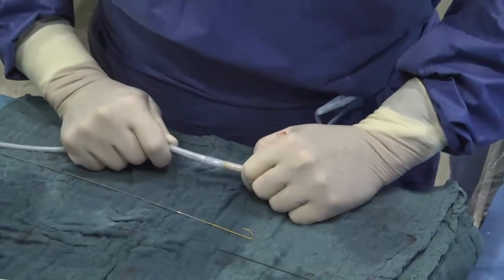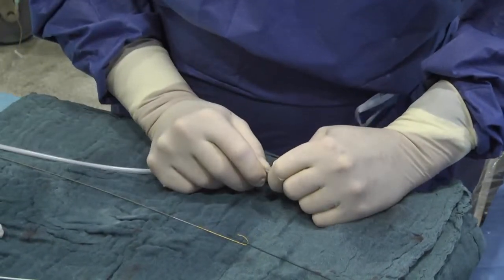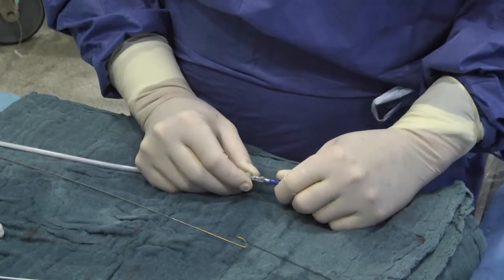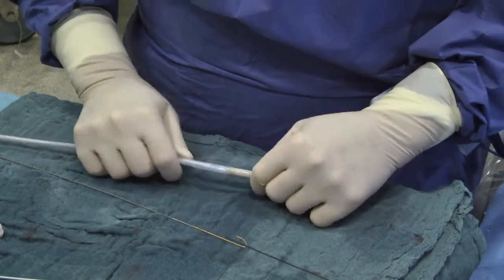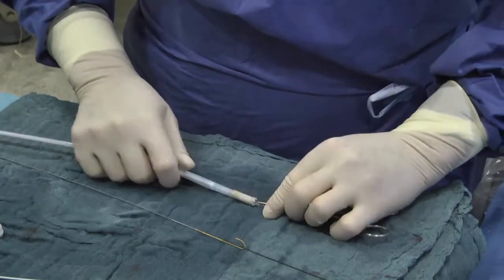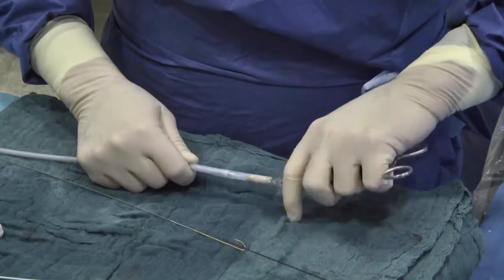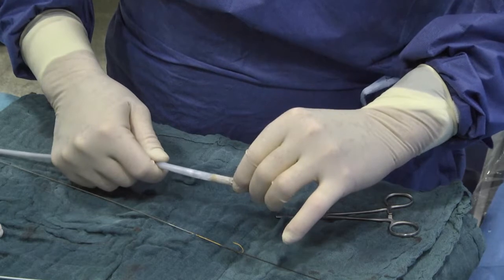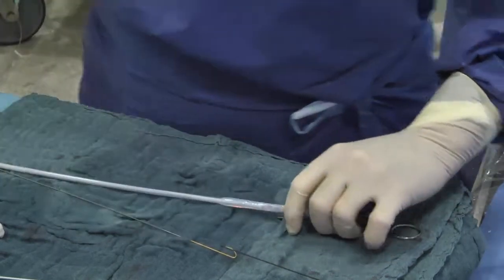I will need to... sliding. Can you inflate the outer balloon a little bit, and then retract the cover when you are at the target lesion? Say it again. Outer, yeah. Have you encountered any case similar to what you're doing now? When you are at the target lesion, you cannot uncover the valve? No. I mean, uncovering. Okay, and now you go first.